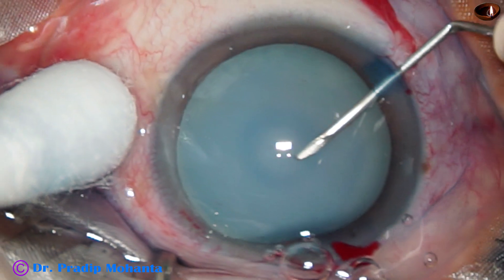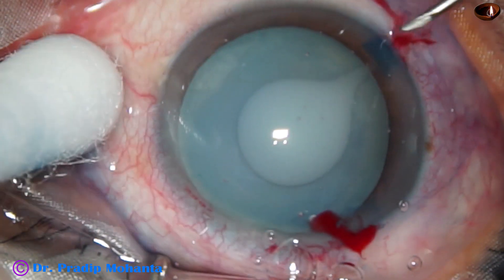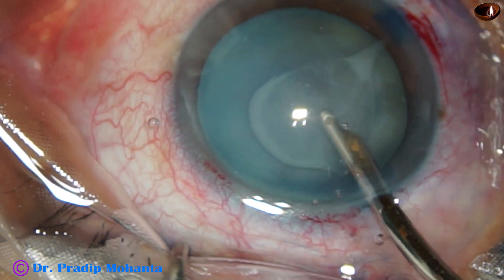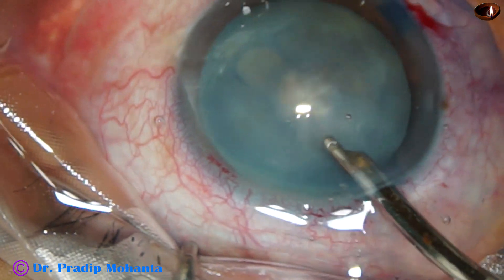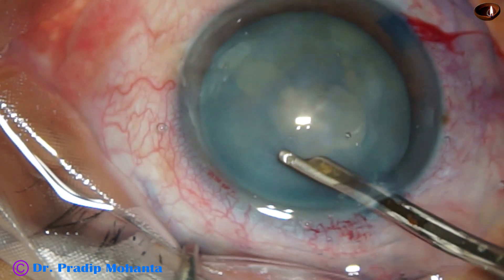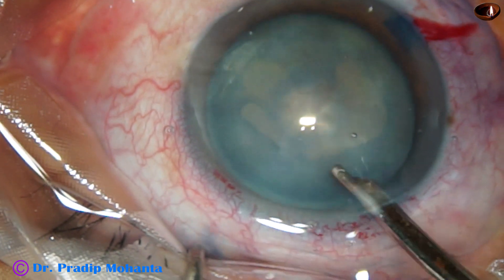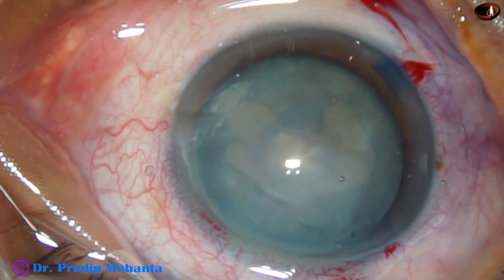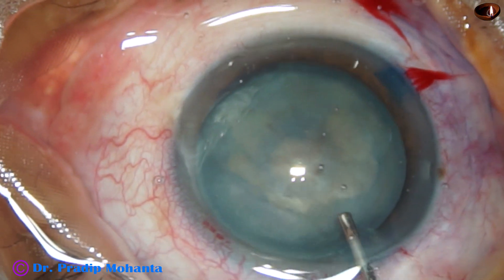See what happens. As soon as the anterior capsule is incised, milky fluid comes out. And we can aspirate this milky fluid. The punctured side doesn't go into Argentine flag sign in hypermature Morgagnian cataracts. Because as soon as the milky fluid comes out, the intralenticular pressure reduces drastically and the punctured side doesn't extend to the periphery.